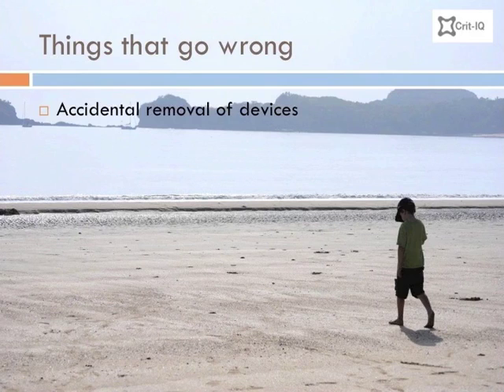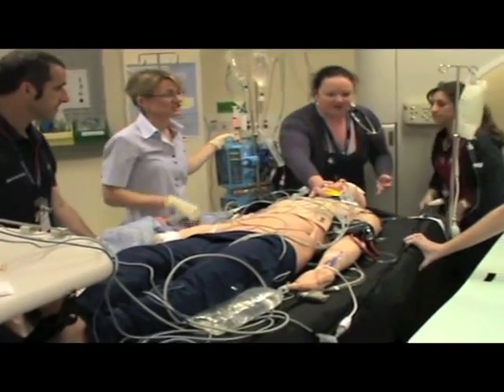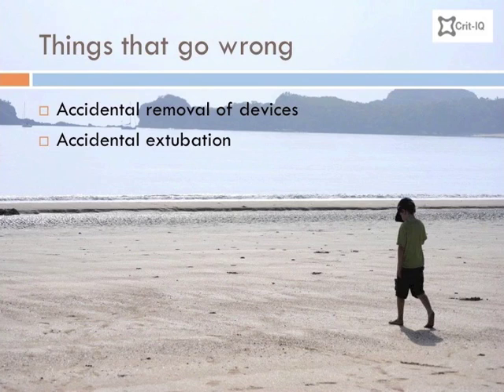When moving a patient, there is always the potential to accidentally dislodge something important. Tubing can become easily snagged around door handles, bedsides and other obstructions, or be dislodged due to the movement of the patient. Disconnection of the endotracheal or tracheostomy tube from the ventilation circuit can potentially go unnoticed for some time. If adequately oxygenated, falling saturations are a late sign of disconnection. Failure to address this situation is obviously a potentially life-threatening mistake.